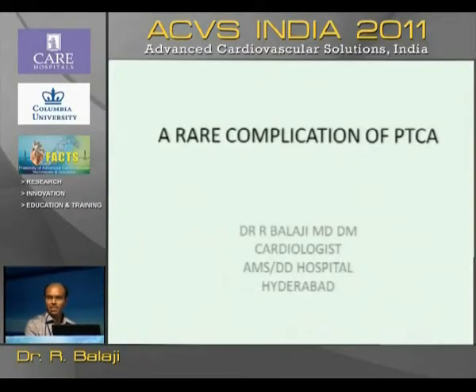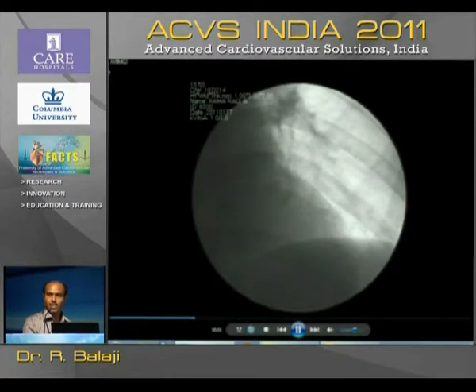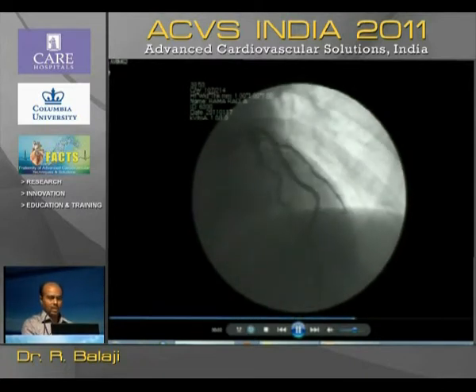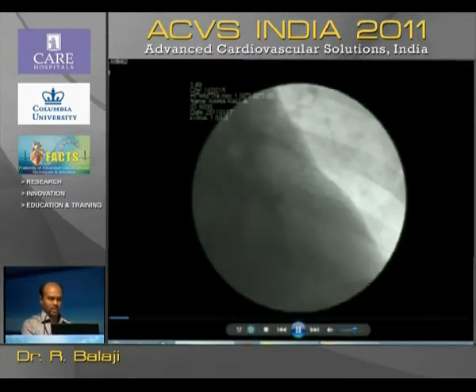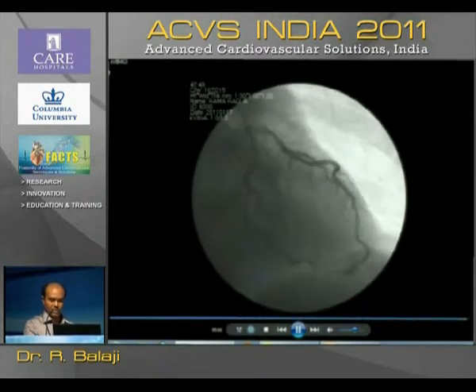This is basically an angiogram of a 60-year-old male who had an inferior ST elevation MI 3 days prior. He's non-diabetic, non-hypertensive, and had an uneventful recovery. He had a successful thrombolysis. This is the injection showing the left side, and the left system is quite normal.